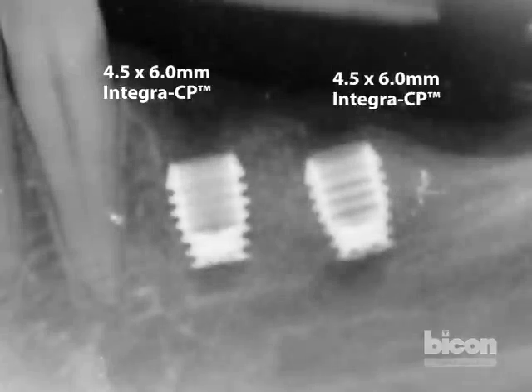For this case, we have two 4.5 by 6 millimeter implants placed in the area of the posterior left mandible, which required coverage of the shoulder with a bone graft and membrane. They are placed exceedingly close to the posterior mental foramen; however, there is no paresthesia or any neurological symptoms. We will go ahead and uncover the two implants, verify integration, and then I'll turn it over to Dr. Morgan, who will take the impression, shade, and bite for the final restoration.